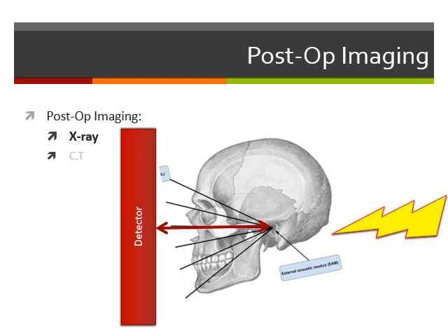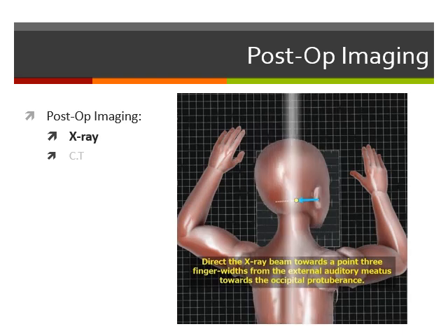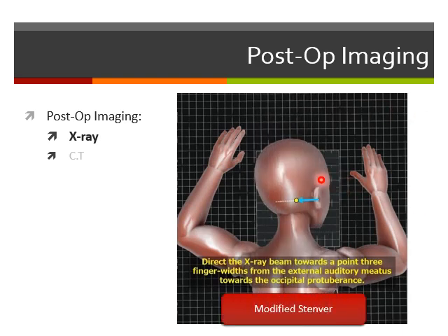Also, the child or the patient has to rotate his head 45 degrees with the side to be tested closer to the detector than the other. As we can see here, I want to test the left side. So I make the child face the detector with his head slightly flexed, then turn his head 45 degrees towards the right.